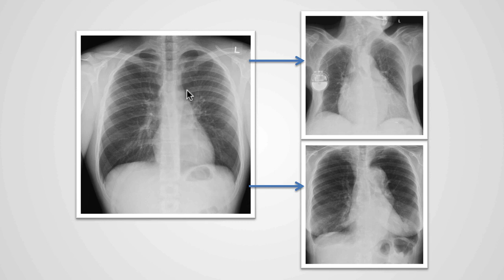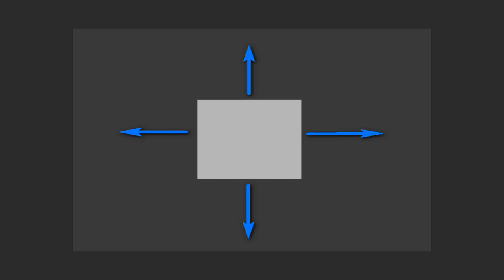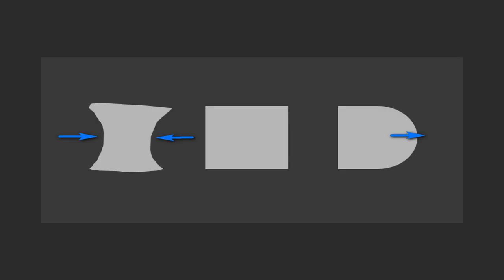The normal thoracic aorta lies in this region. In this case, the interface we are seeing is caused by a grossly dilated aorta in this patient with a thoracic aortic aneurysm. The gray scale of a structure can stay the same, but the structure can be displaced horizontally or vertically, or the shape of the structure can become distorted.